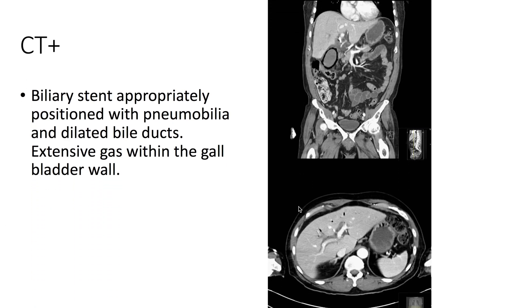On CT with contrast, we again see the biliary stent. However, we also see pneumobilia, as well as dilated bile ducts. Additionally, we see extensive gas within the gallbladder wall.